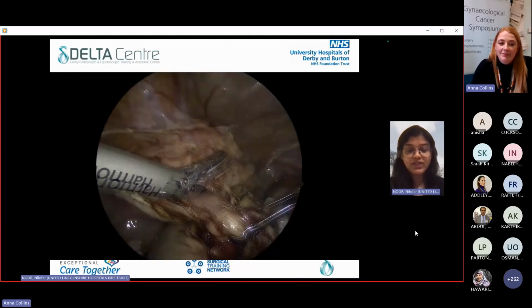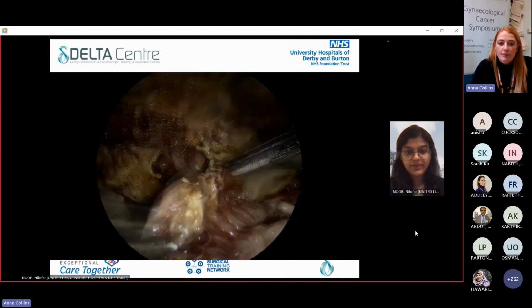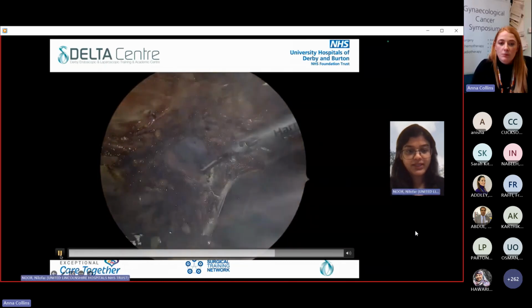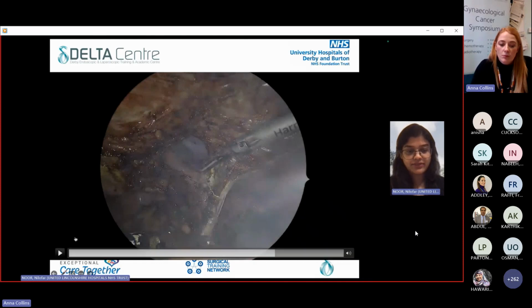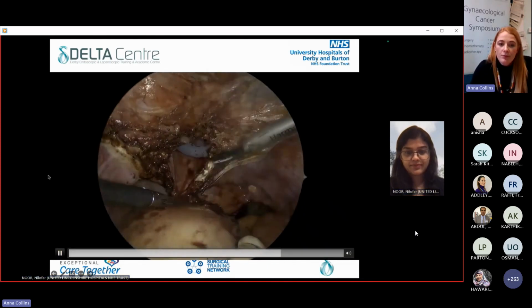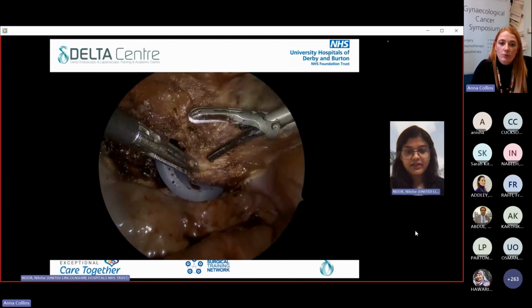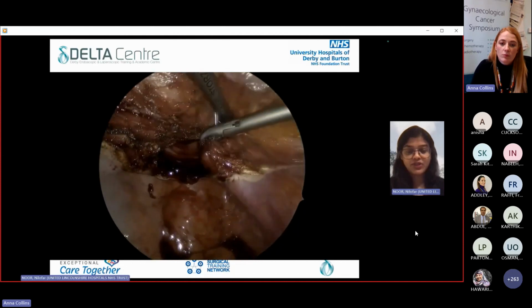Once adequate cervicovaginal area was identified, colpotomy was then done. A swab on a stick can be noted in the vagina here. There was inadequate space to insert the tube and to deliver the uterus through the vagina. Therefore, the vault was widened to allow for this to be done safely. The bladder was further reflected to create adequate vaginal length for safe closure of the vault.